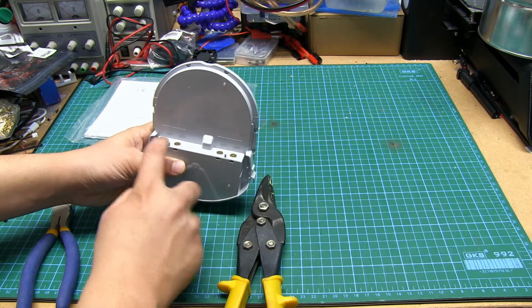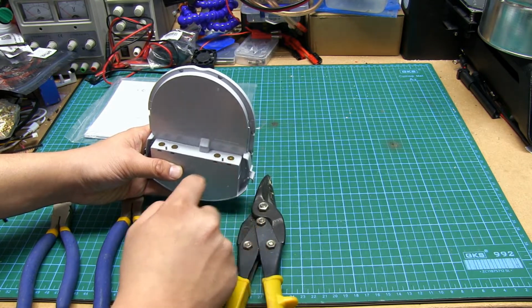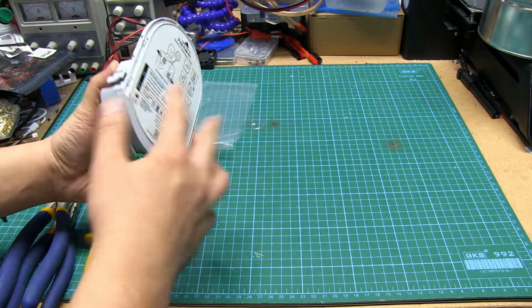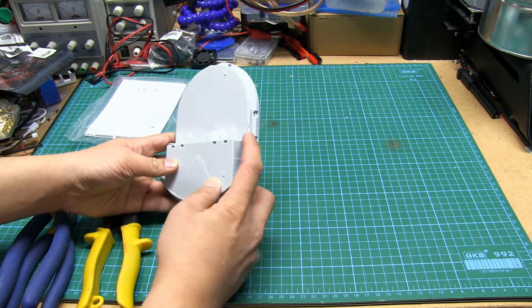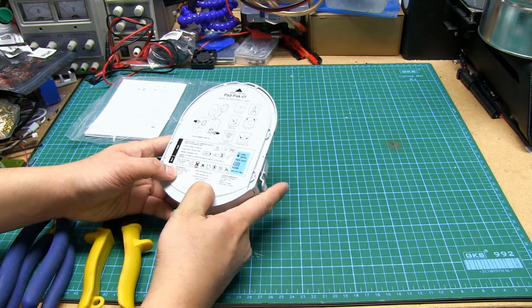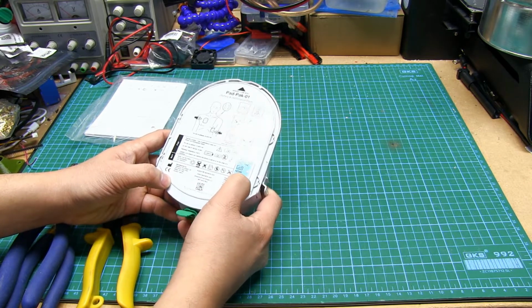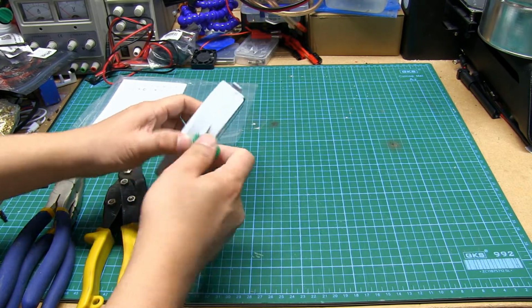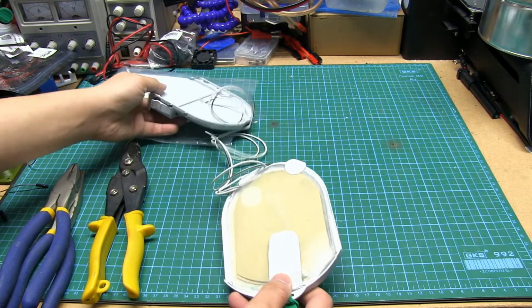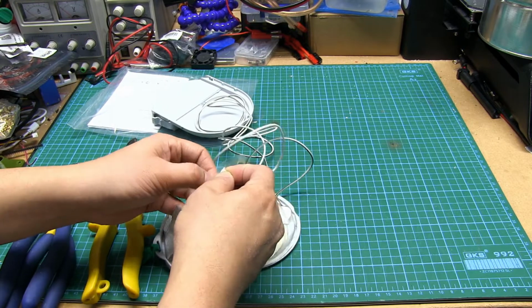On the pack itself, you've got some gold contacts, one of which has a slight char mark on it as a result of overcurrent discharge, maybe? Just for some completely unrelated reasons. Some in-molded plastic clips that snap into the unit itself, some tracing and tracking barcodes, and an expiry date sticker on it. When mounted itself, you use this pull tab to release the pads themselves. I think it's been about 3 to 4 months since, so I'm curious whether these still have any stickiness.